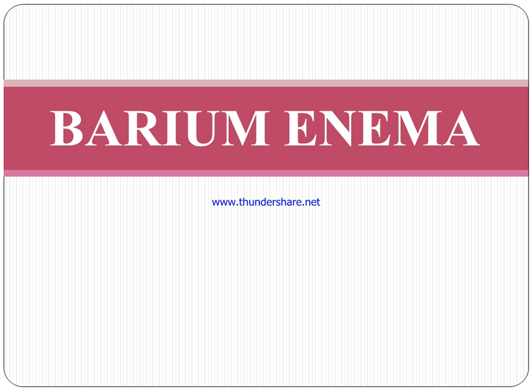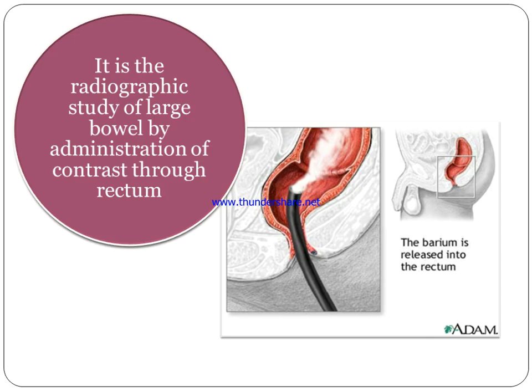So let's start our today's topic of barium enema. Basically, barium enema is a radiographic examination of our large bowel by the administration of contrast media through the rectum. In this procedure, we use barium and we inject barium through the rectum of the patient to examine the large bowel.